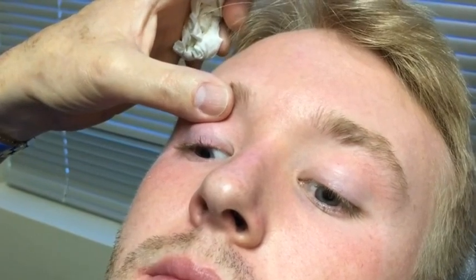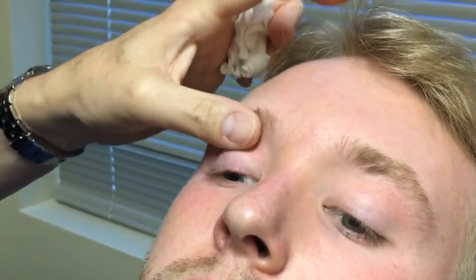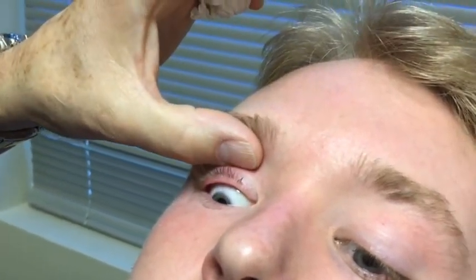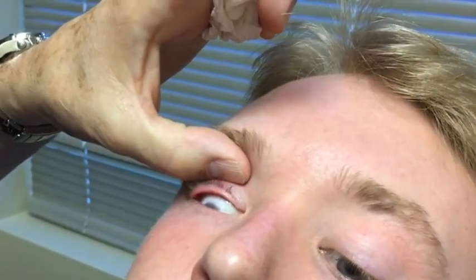This is counterintuitive, but what we're going to do is we're going to roll down. So my thumb's going to roll 90 degrees down. And while I'm rolling down, I'm also going to push in. And you see how that pops the lid margin out. I'm going to demonstrate that again. So we're going to roll down towards the floor and push back into the superior orbital sulcus.